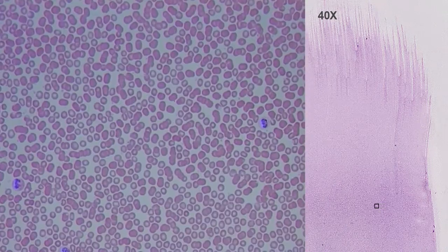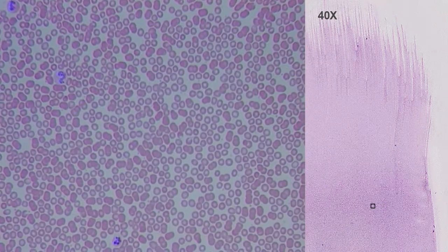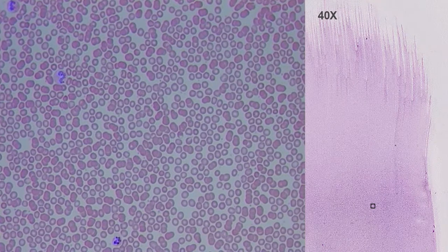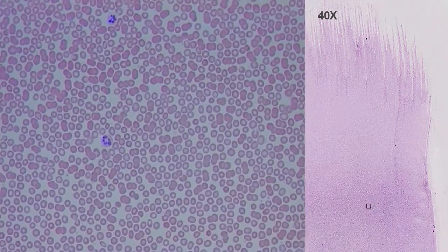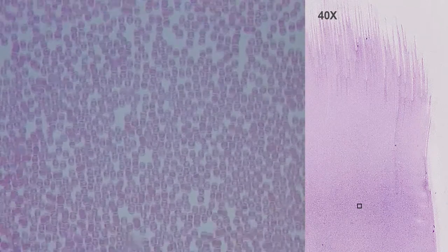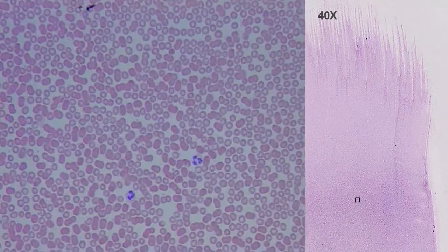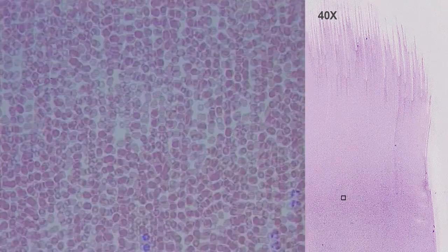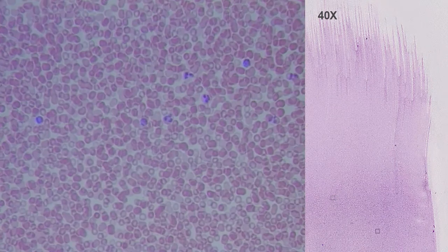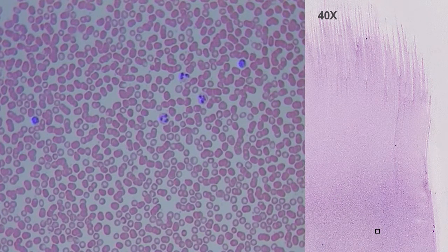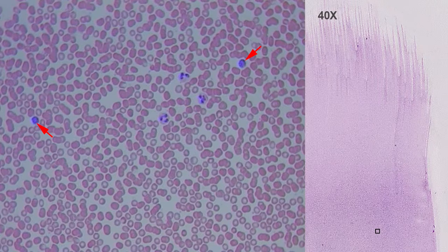We continue scanning the preparation and looking at the cell types present. The lymphocyte is the smallest of the leukocytes. Its nucleus is spherical and occupies almost all of the cytoplasm.